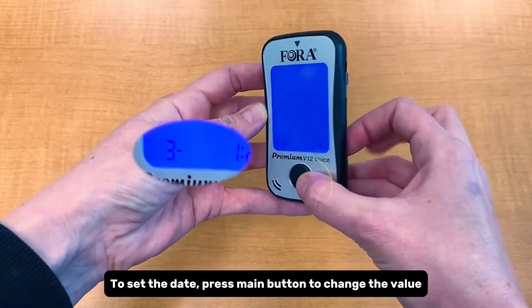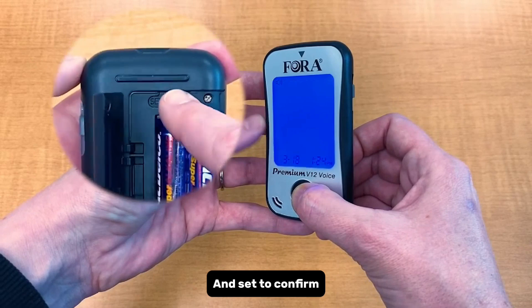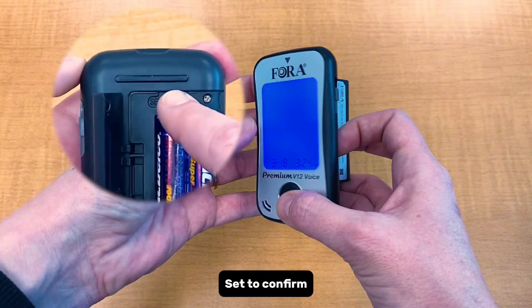To set the date, press the main button to change the value, then press set to confirm. To set the time, press the main button to change the value, then press set to confirm.